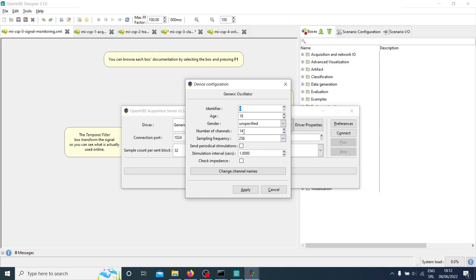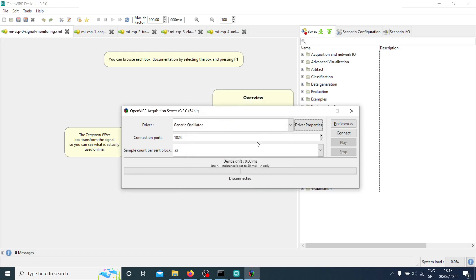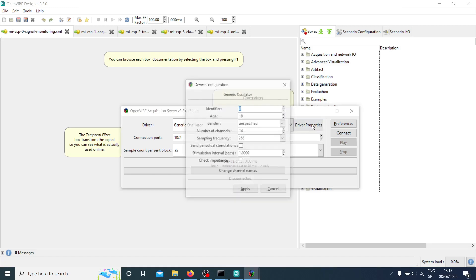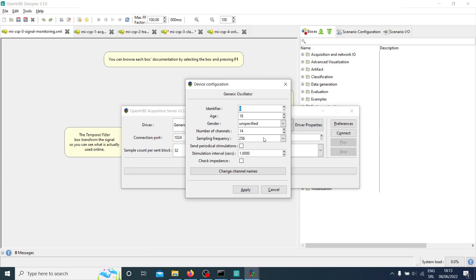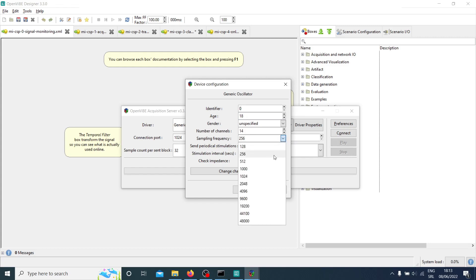By default we have four channels, but I've augmented them to 14 because the spatial filter showed an error earlier. The CSP spatial filter expects more than four channels because it reduces the number of electrodes — for example, from 14 down to only four. So if you give it only four channels, it will give you an error. That's why everything is already opened — I realized that was a mistake.